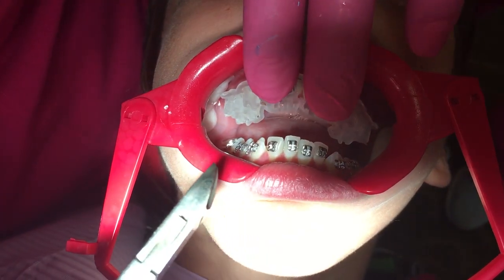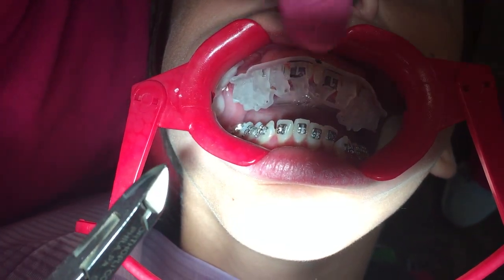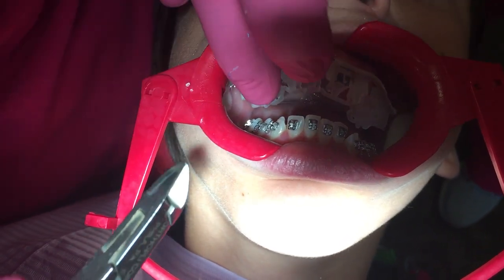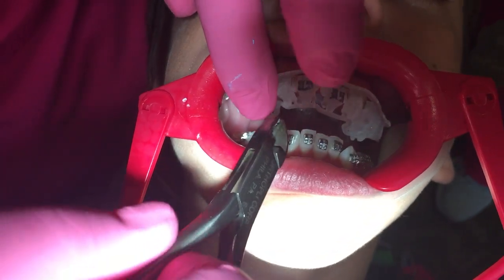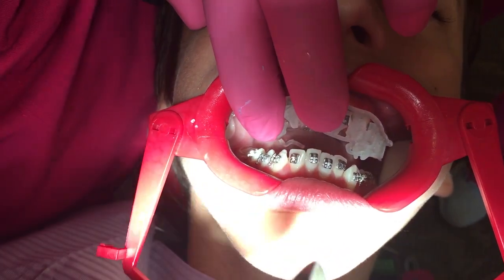Now, in between canine and bicuspid, put your hand — your finger — your index up closely on those, and pinch it. Yeah, you can hold it in there. Pinch. Good. And grab that right away.